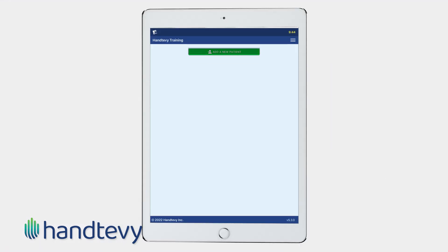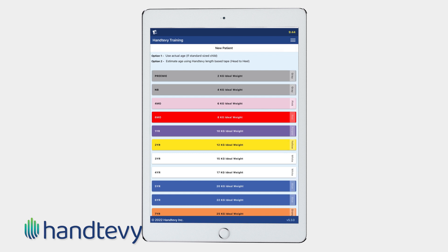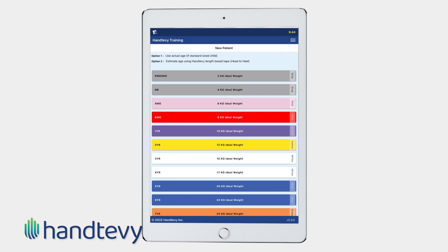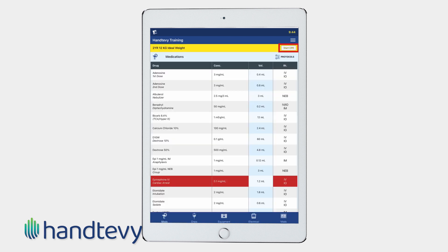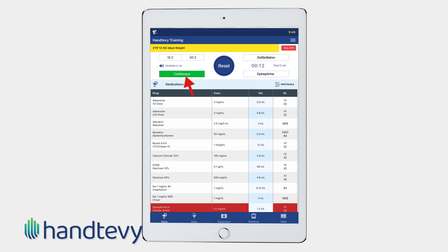On your way to the call, begin by selecting a new patient, then select the age and simply start CPR. As soon as you make patient contact, the metronome compression rate can easily be changed between 15 to 2, 30 to 2, or continuous once an advanced airway has been placed.